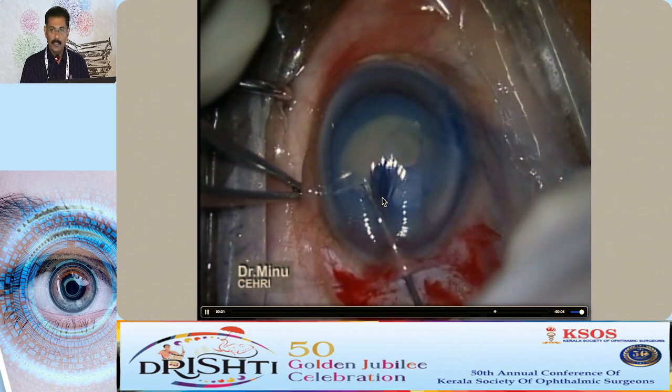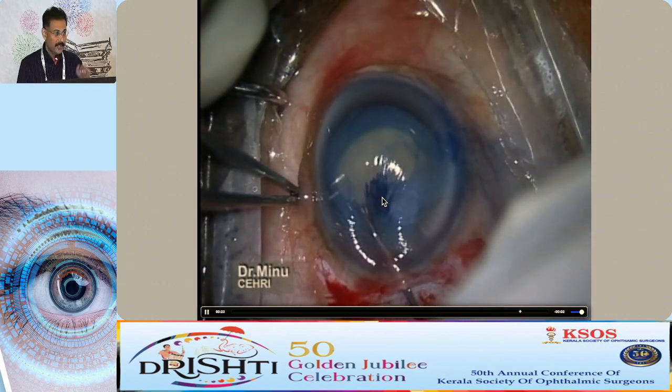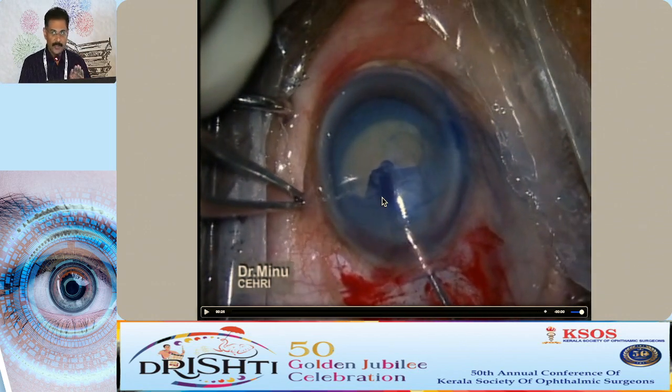Second thing is learners hesitant to press down. So if you keep on going, suggesting that you will now enter, okay, go a little more, you'll keep on going, and finally you'll end up going too far anterior. So at the point where you want to enter, dip down, press, go in, and then straighten out the tip, and then complete the entry.